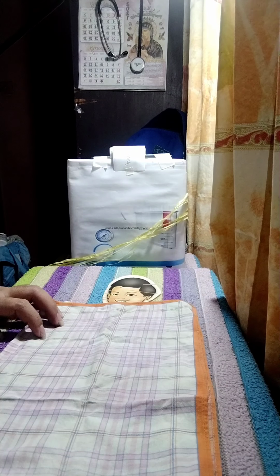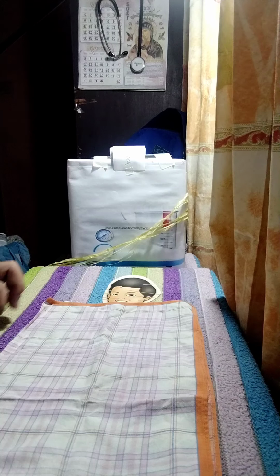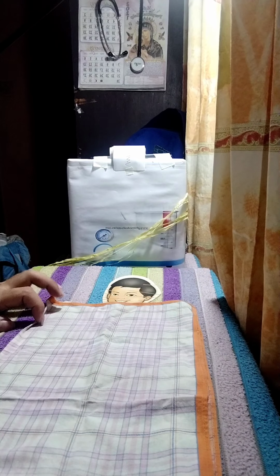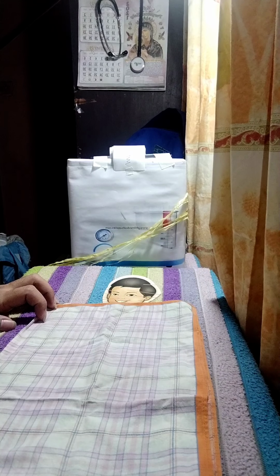Next, we need to assess the cardiac status. Next, we need to keep the patients away from the objects that might cause electrical interference. And lastly, we need to inspect the patient's chest for areas of irritation, breakdown, or excessive hair. For planning, verify the order for an ECG on the patient's medical record. And then, gather all the equipment needed and bring it along to the bedside.